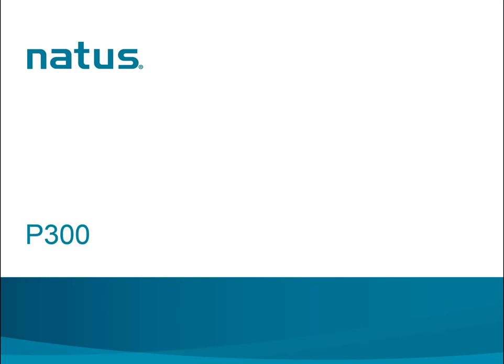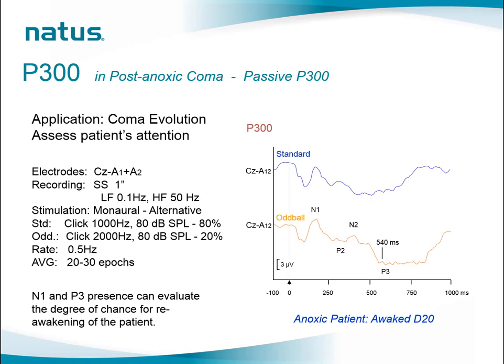I want to talk shortly about late responses. Late responses, one of the most known tests is called the P300. This is a test that is used to assess patients' attention, and it may be applied in ICU to assess the evolution of the coma and chances of awakening of the patient. The electrode setup is the same as for the short latency testings that we have just discussed. However, the stimulation is different.